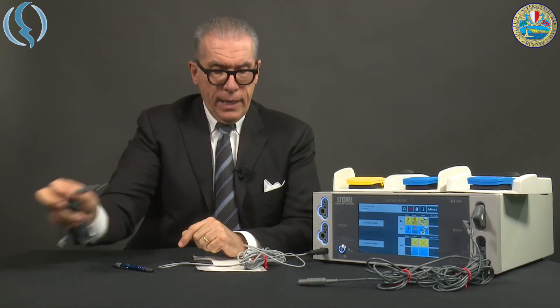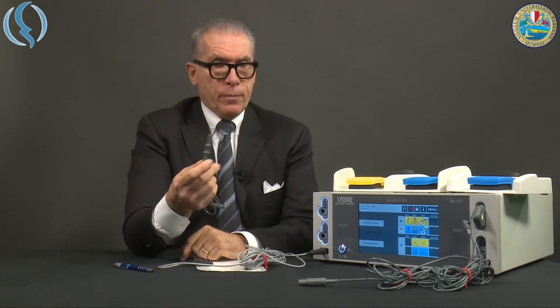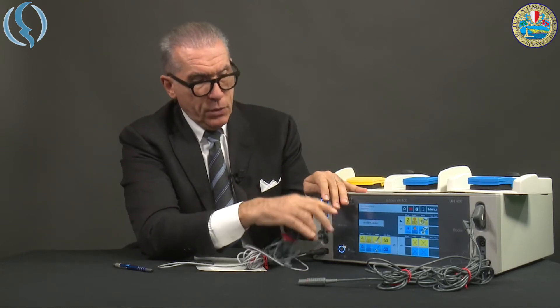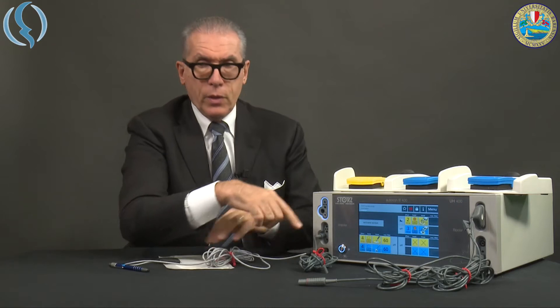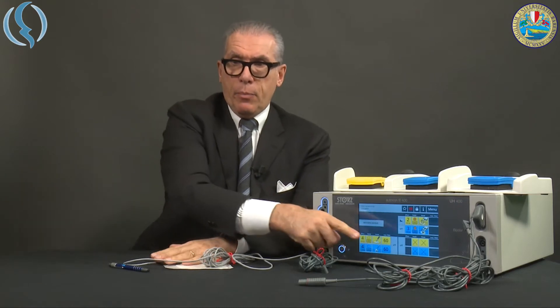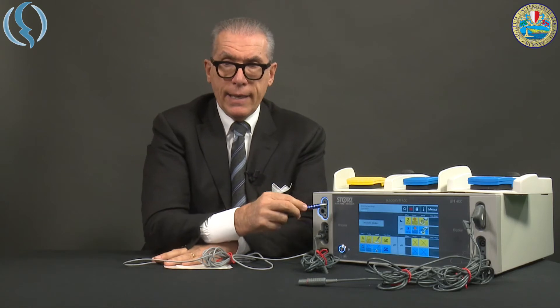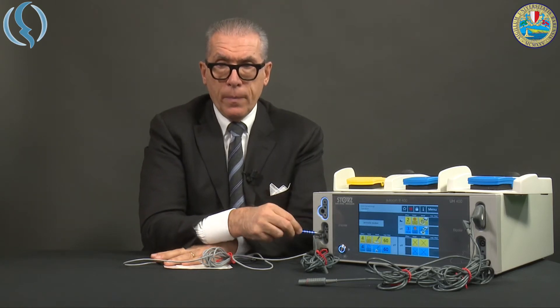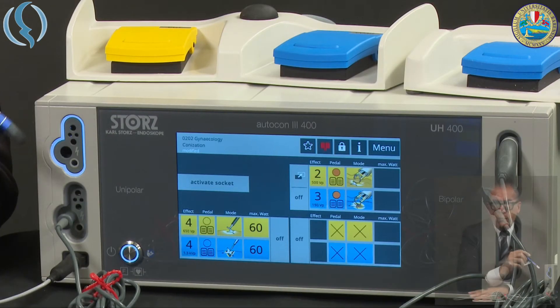And finally the monopolar cable, which we insert here. As you see, as soon as we insert the cable, the menu appears on the screen and the light around the socket turns off. Now we are ready for the setup.